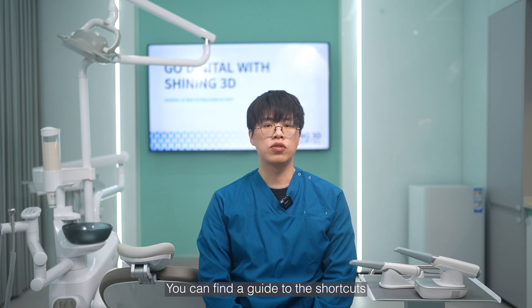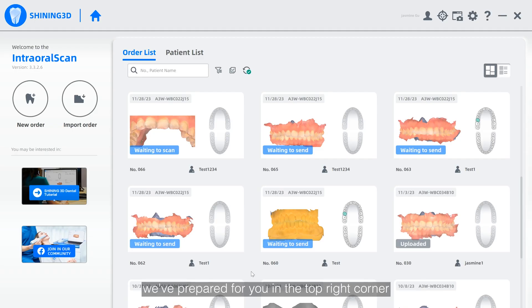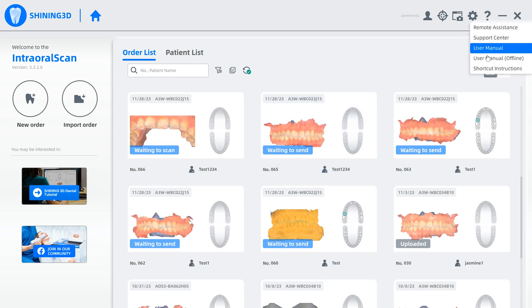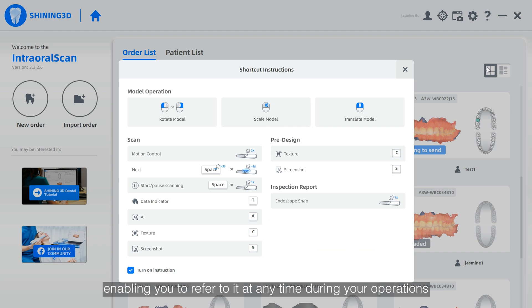You can find our guide to shortcuts we've prepared for you in the top right corner of the software interface, under the Help section, enabling you to refer to it at any time during your operations.